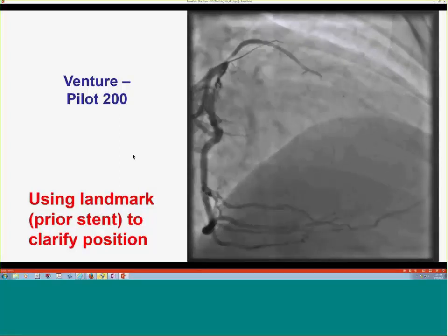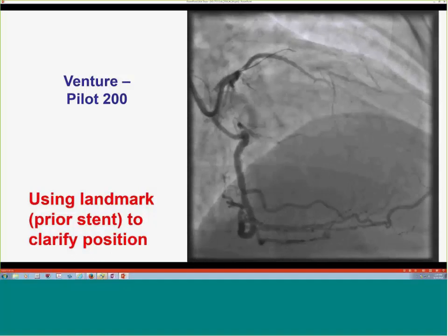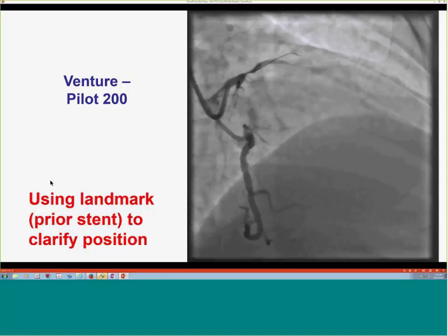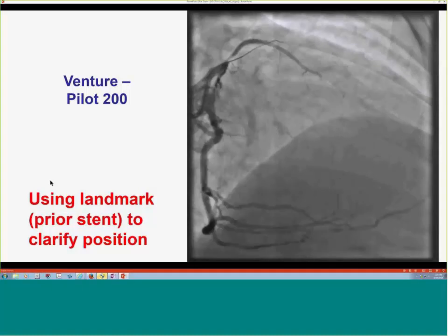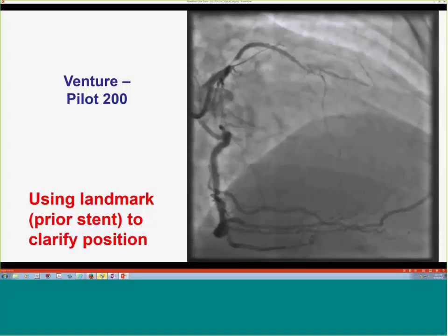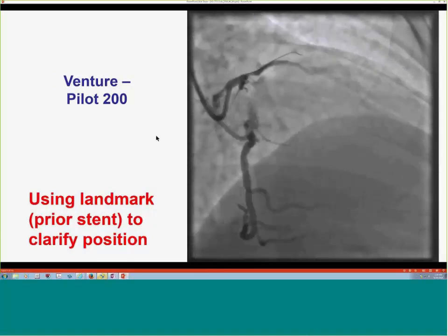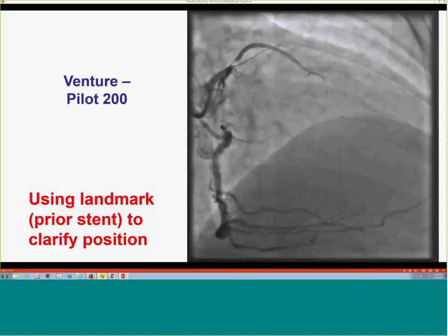I don't know if anyone would just try primary retrograde for this case, given it's a long vessel and long occlusion, it has a lot of calcium and stent there as well. Well, the proximal occlusion is a stent. So if you can go through that, then you're just dealing with the secondary occlusion, right? And then you might be able to do dissection reentry because that acute marginal, as you said, is really an epicardial. That's right. Yeah, they're both epicardials, both the acute marginal and the PDA. I like the fact that you have the stent there. I think that's probably the right strategy. Try to get the first one done, and then reassess the second one. I think it may not be as hard after you improve the flow there.